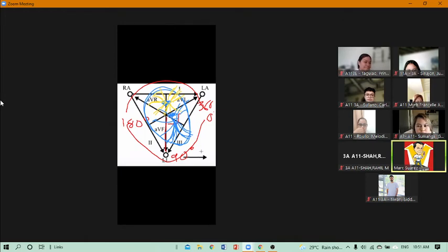So the bundle of His and the Purkinje fibers. Okay. As we are dealing with impulses or depolarization, there is a negative and there is a positive side, right?